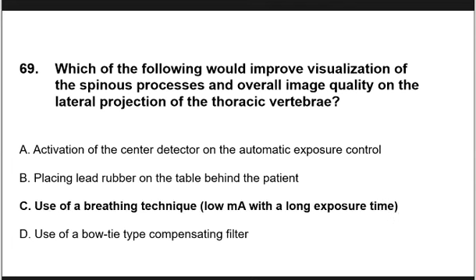So we have to use breathing technique. Na? So breathing technique ang instructions natin dito. So pag sinabi nating breathing technique, that is just referring to slow breathing or quiet breathing. Yan. So yan ang projections natin na ginagamitan natin. One of the projections in which we are using the breathing technique.